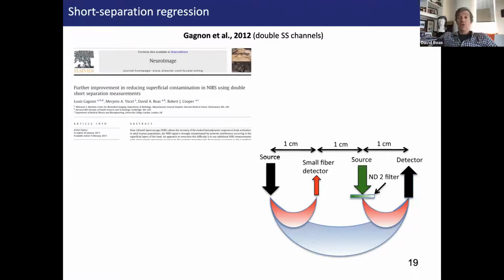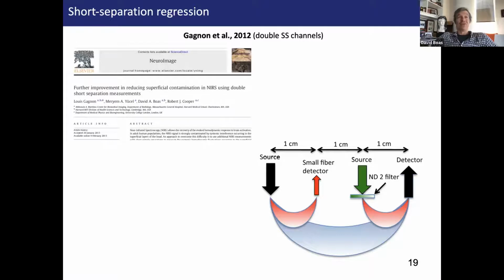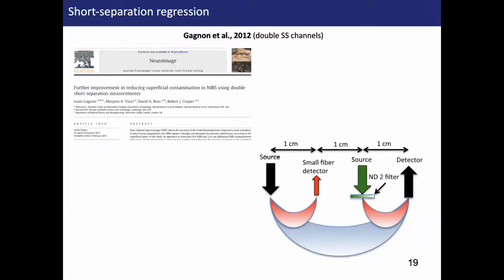The way we detect that is we just use the short separation channel that's most correlated, right? So the assumption there is that not all short separation channels are noisy. If all of them were noisy, well then that wouldn't work well. So if you want to protect yourself against that, we have objective ways of rejecting channels that are too noisy. And if you try to do short separation regression, but you had no short separation channels, it wouldn't do anything. Okay, right. Thank you. Does that make sense? Yep.